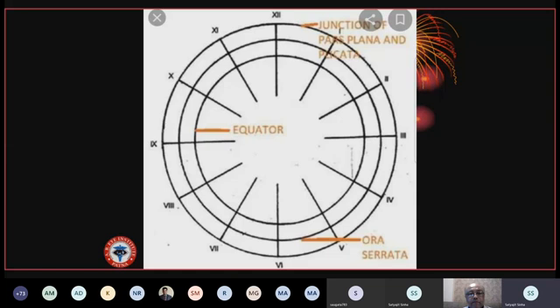So when you are drawing on the fundus chart, you have to draw the ora serrata first with black curved lines nasally, because you know that the dentate processes are more prominent nasally. So those curved lines come on the nasal side, and then it basically follows the contour of the ora on the left hand side.